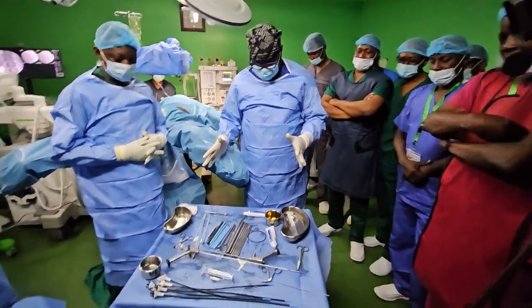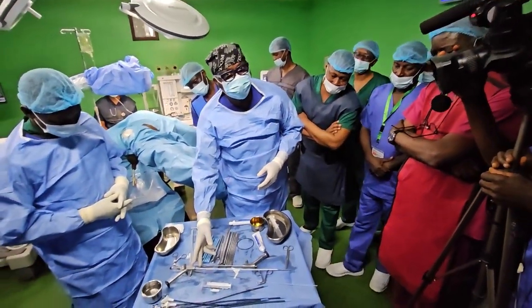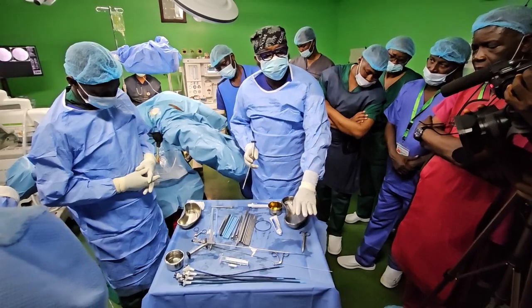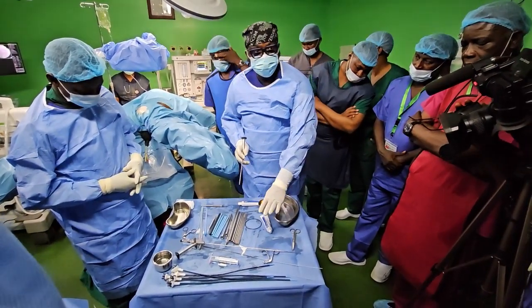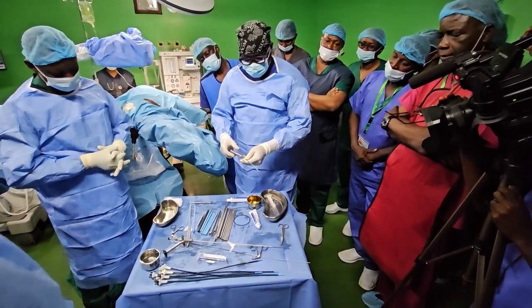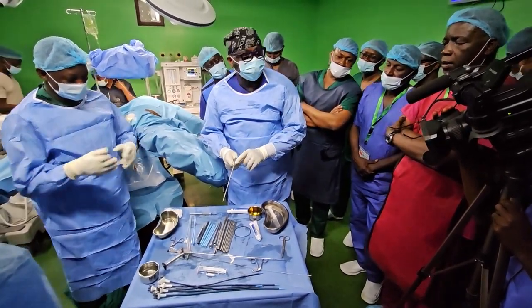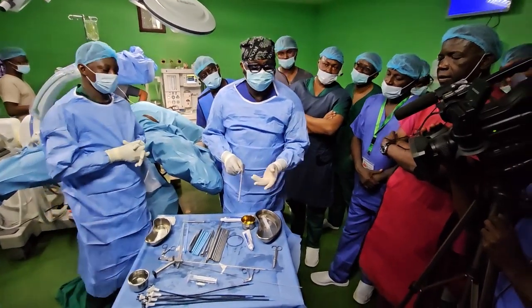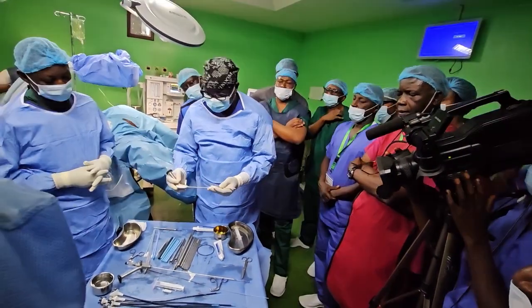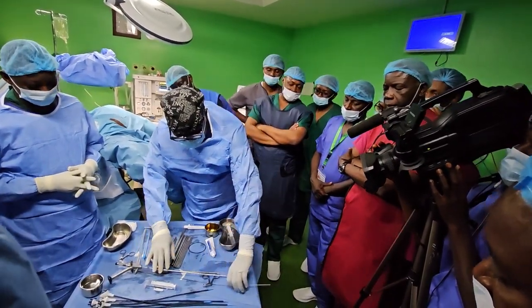What our tray looks like. Okay. So for our scopes, semi-rigid, 7.5 French. Then the nephroscope. The semi-rigid has finished its function. That's what we used to place the guide wire and then subsequently the ureteric catheter. So we're going to be using the mini nephroscope. What French is that? By Karl Storz, 12 French. Okay, they actually call it a pediatric nephroscope, so it's a mini nephroscope. Beautiful and very expensive, 8 million. So that's the miniscope, the 12 French nephroscope.